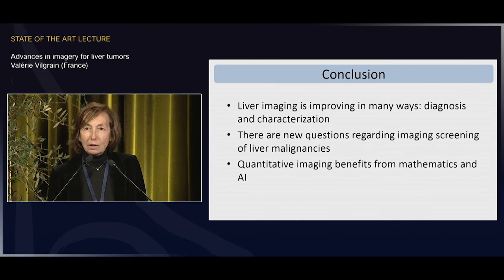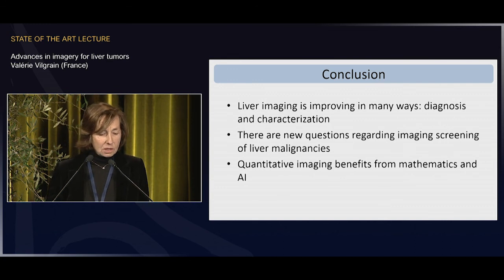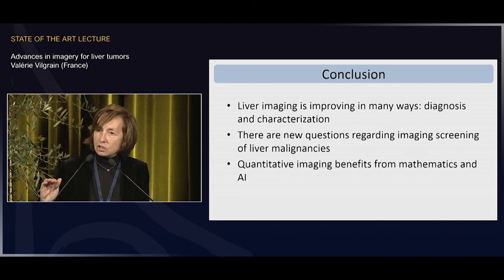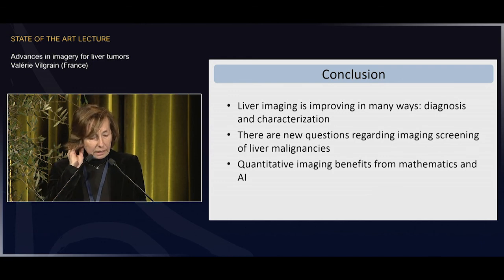I hope that you are convinced that liver imaging is improving diagnosis and characterization in many ways. There are new and very interesting questions regarding screening of liver malignancy, HCC, and liver mets, and also quantitative imaging benefits from mathematics and artificial intelligence.